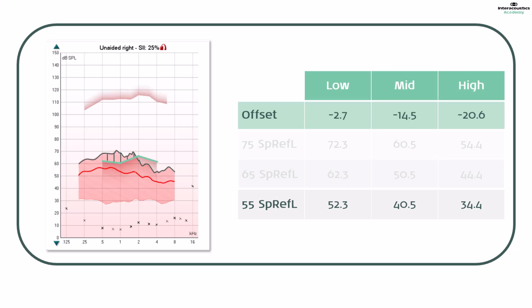As a result, it may be valuable in this case to perform the cortical test, as very little of the test signal is going to be audible unaided, and so aided benefit may be demonstrated by the results of the test in the aided condition.